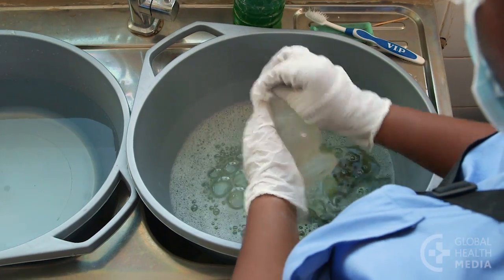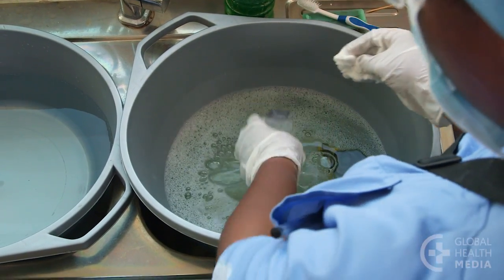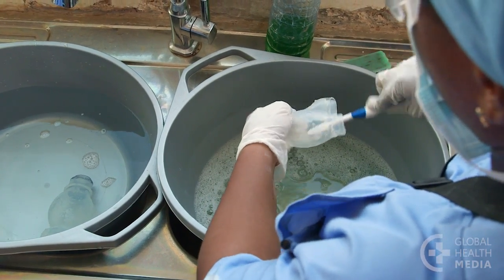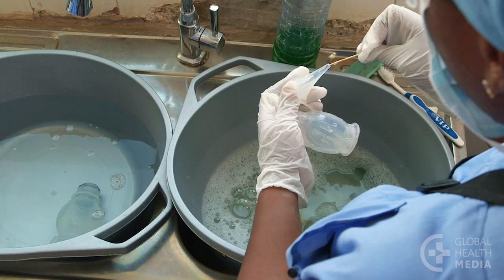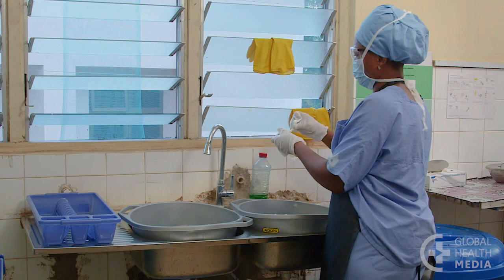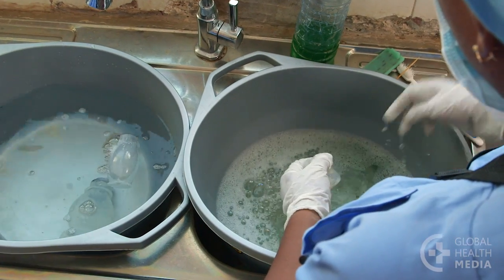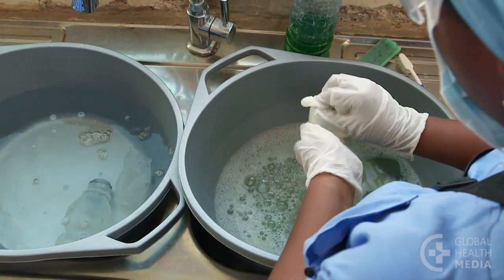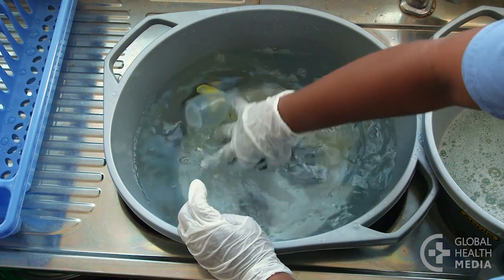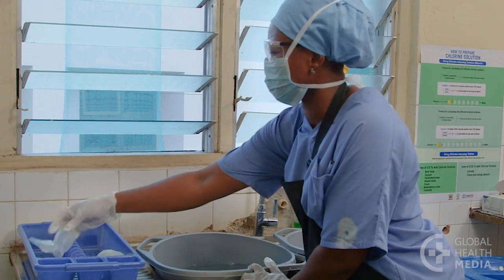Now scrub all surfaces of each part inside and out in soapy water. Use a clean cloth and a soft brush. A toothpick can be used to clear the tip of the suction device. After washing, drop each piece in a bucket of clean rinse water. Immerse the parts and move them around in the water to remove the soap. Then set them on a rack to dry.